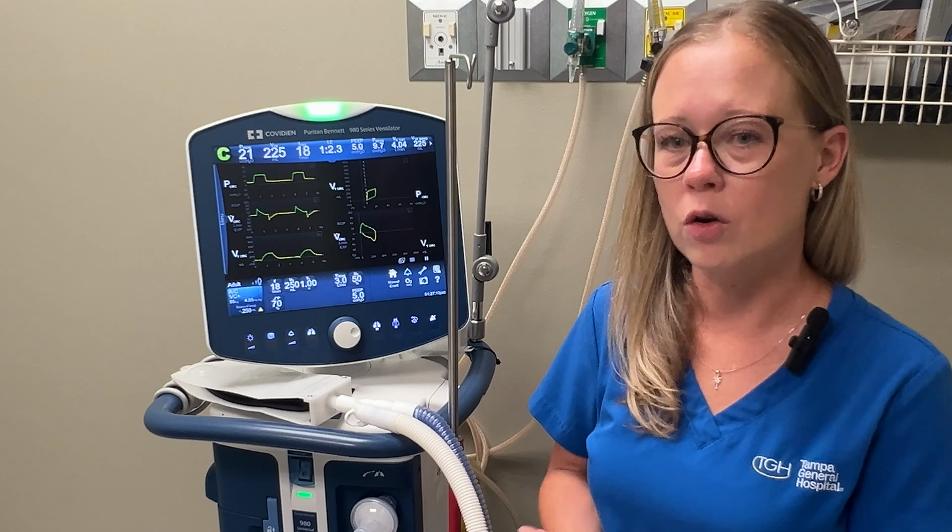Right here, this letter C means that the patient is in a control setting. That means the vent is doing all of the work. If you see an A there, that means the patient is receiving assisted breaths, which means the vent is helping them, but still doing most of the work, but the patient's initiating their own breaths. It may be a lot of breaths, it may be a few breaths, but if you see that A, then you'll know that the patient is initiating their own breaths.